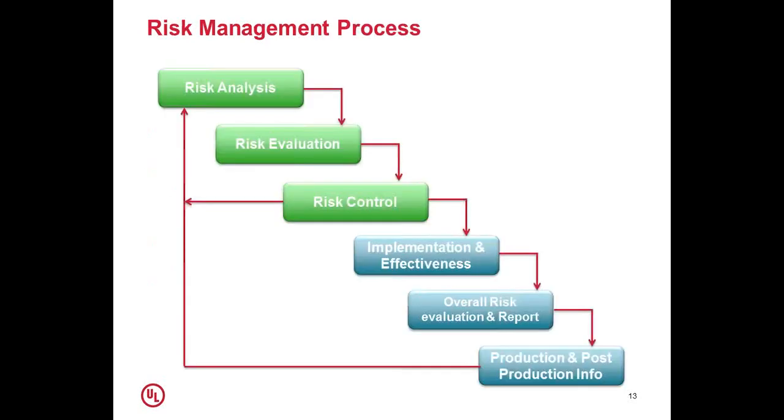For the risk management process in a medical device, we will have to comply with ISO 14971. ISO 14971 is an internationally accepted standard, and it is necessary as a part of the process and as a part of the product development program, whether it is hardware or software. A risk management process needs to be available.